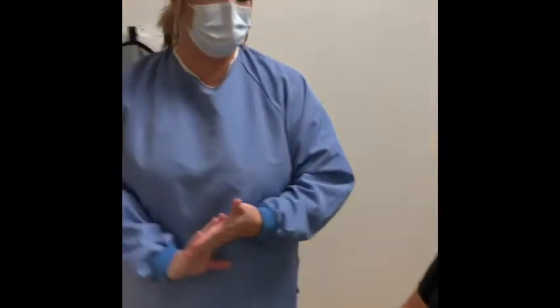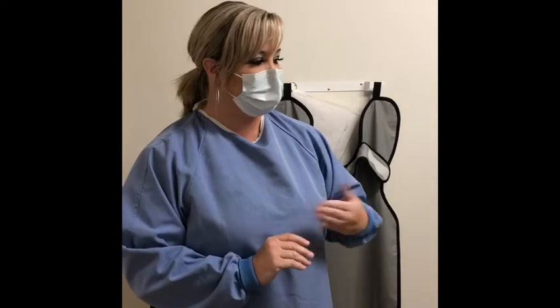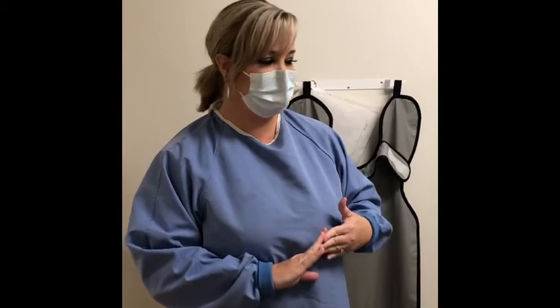typically you would go over their health history here, go over any questions they may have, take their blood pressure with the wrist cuff and note that on their health history. And then we want to go ahead and obtain consent, meaning we need to make sure the patient knows why we're taking x-rays and what we're going to be doing. The doctor wants us to go ahead and take some x-rays today. Is that okay with you? Yes. Okay, so we obtain consent.